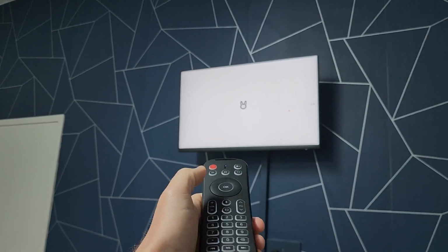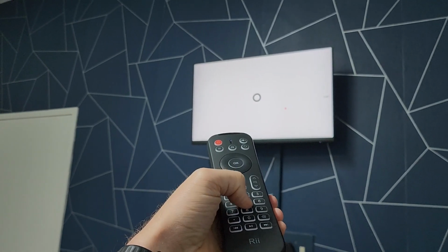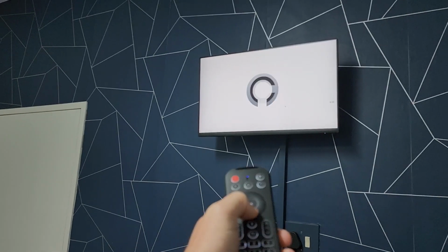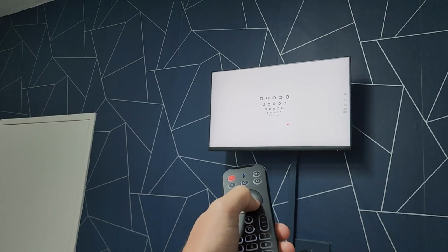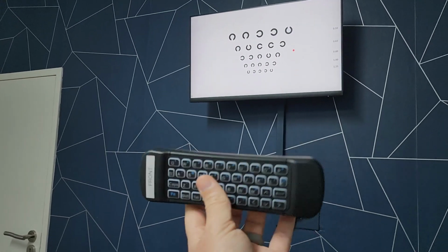You can see this for pediatrics. There are Lea's pictures as well if you want Lea's. There's E's and C's, etc. And you can obviously have large letters. You can have lines like that, or you can have a chart if you really want, and you're going up and down. But this controller is from Takealot.